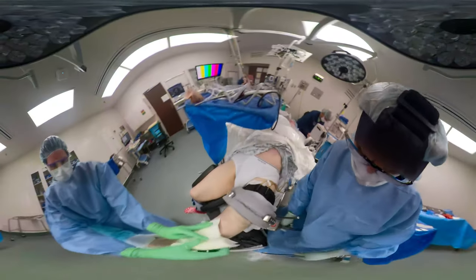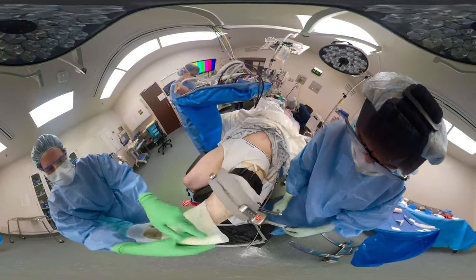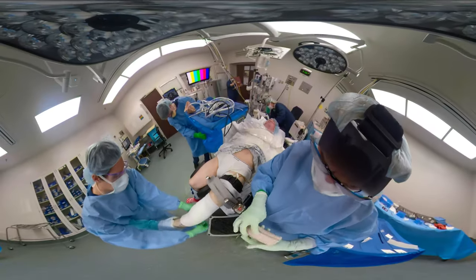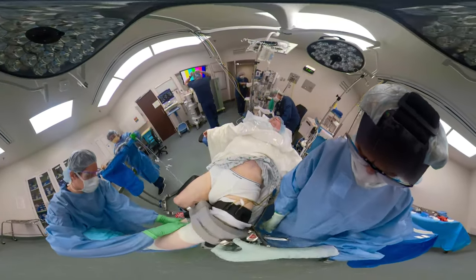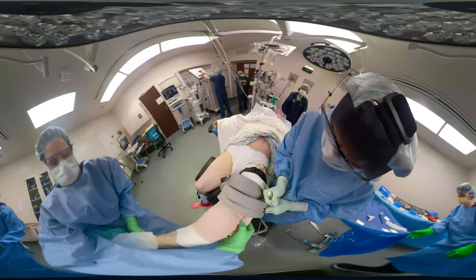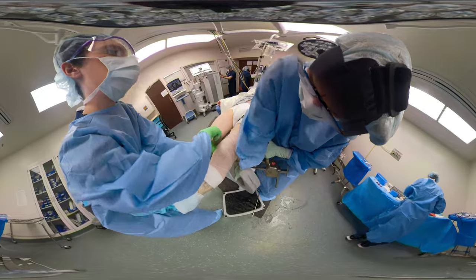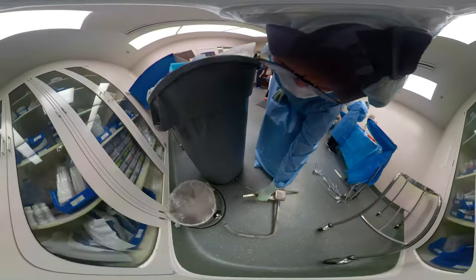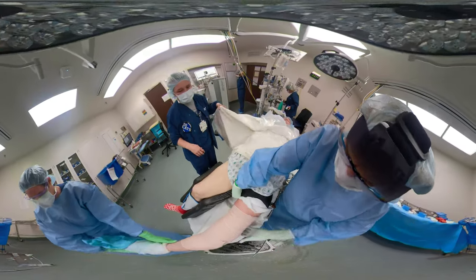Pat them up so they don't call you because they're bleeding. Be careful when you take this Lanny Johnson leg holder off — hold the part that doesn't move up on the top, take the rubber out. If you hold where the trombone effect is down where you put it onto the bed, you will pinch your fingers, and that's not a good thing. Get that leg holder off, holding onto the part that doesn't move. Take the soft rubber padding out, then let the tourniquet down. Ace Wrap not too tight, just from the upper calf to mid-thigh. And that's the left knee arthroscopy, partial medial meniscectomy.